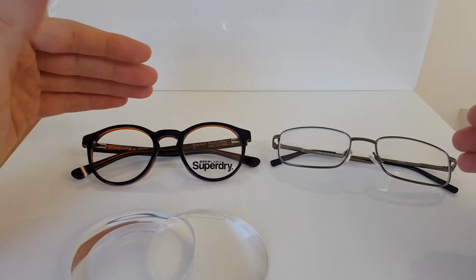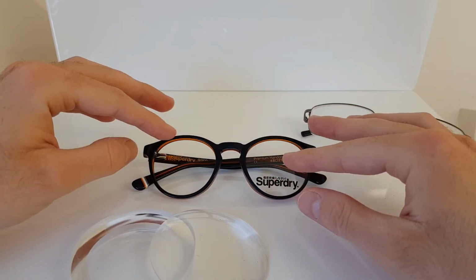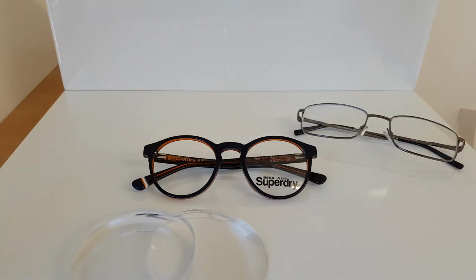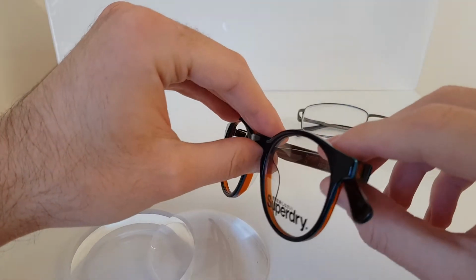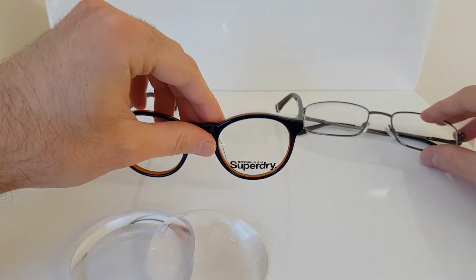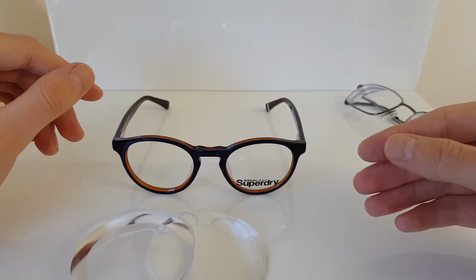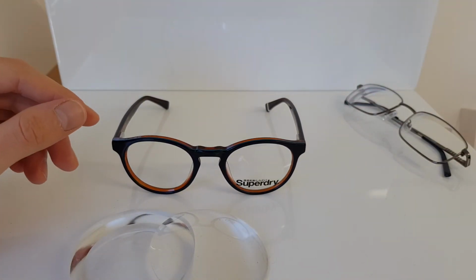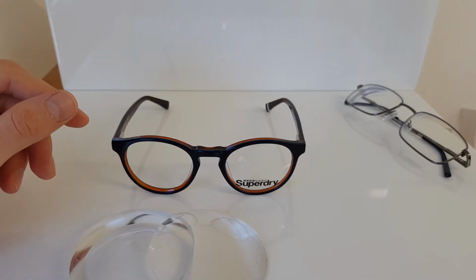But you can mix both things together. So you could have a smaller frame with a round eye size and make the lenses thinner with a high index lens as well. And that's going to basically give you your best chances of getting the thinnest, nicest looking pair of glasses. And obviously what you don't want to happen is to have a pair of glasses which, okay, you love the look and style of them, and they keep sliding down the nose and they become uncomfortable, then they start rubbing. It can kind of be an opening for more problems than just having heavy lenses. There's normally other things that come with that as well.